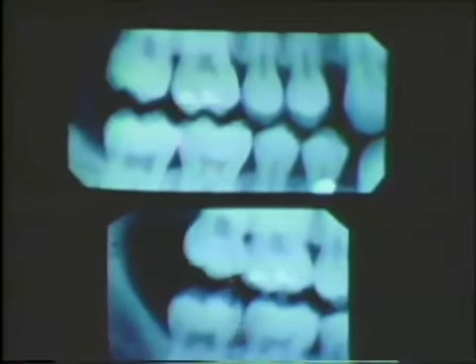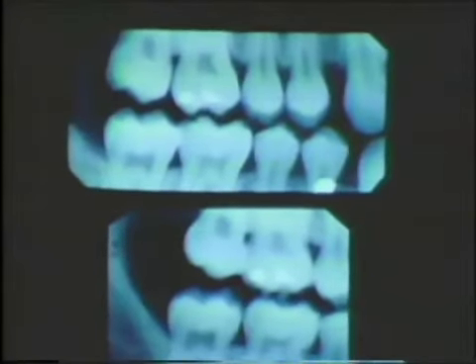All of the maxillary interproximal areas are well visualized. The lower molar contact, however, is overlapped. The remaining mandibular contacts are nicely open. Again, a supplementary film is used to demonstrate the overlapped lower molar contact.